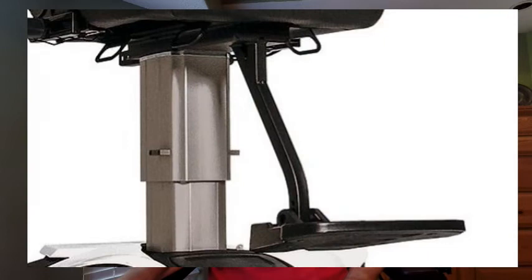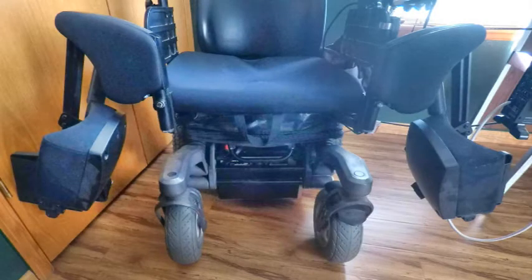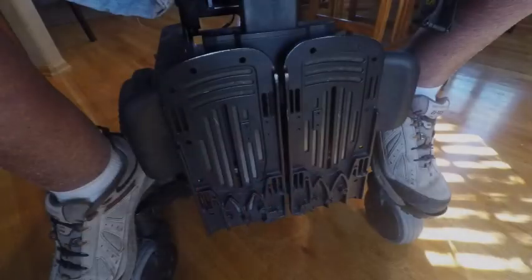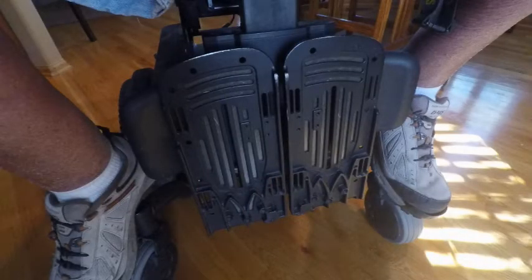Leg rests and foot plates also include many choices. There are stationary leg rests, power elevating leg rests, and swing away leg rests. Also available are single foot plates and double foot plates, both of which must be tilted up in order to transfer out of the power chair. Tilting a foot plate can be a problem for a person with limited arm and hand strength in the later stages of IBM.